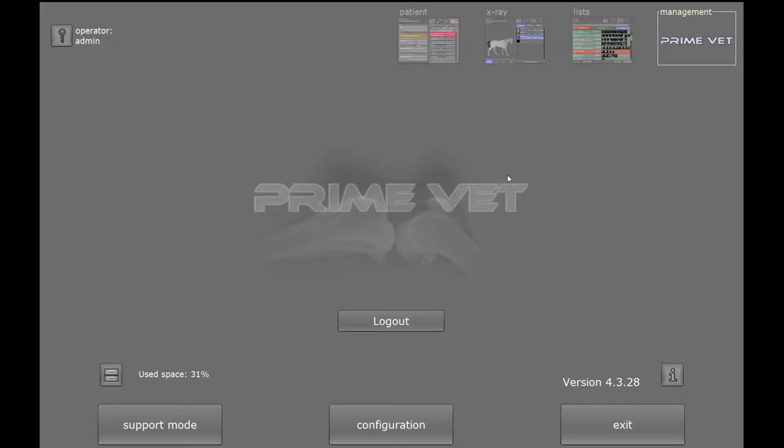Okay, so this is our Prime VET software that we have paired with our Prodigy DR panel. As you can see, I'm already logged into the VET software.